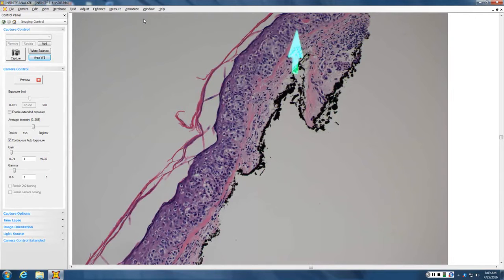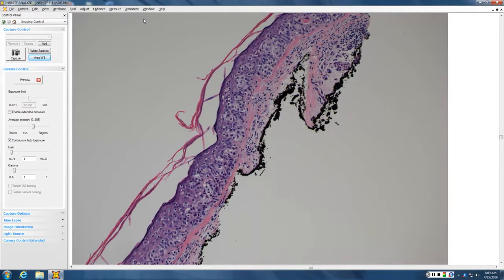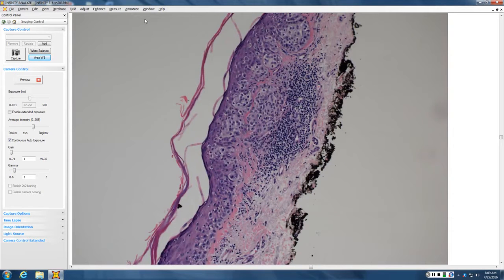But you certainly have nests, and are the nests similar in size and shape? No, there are some very small single units, and there's pleomorphism in the nest size. There are areas where non-nested melanocytes probably predominate over nests. The nests themselves vary in size and shape, and are not equidistant from one another. That looks like it's probably invasion.